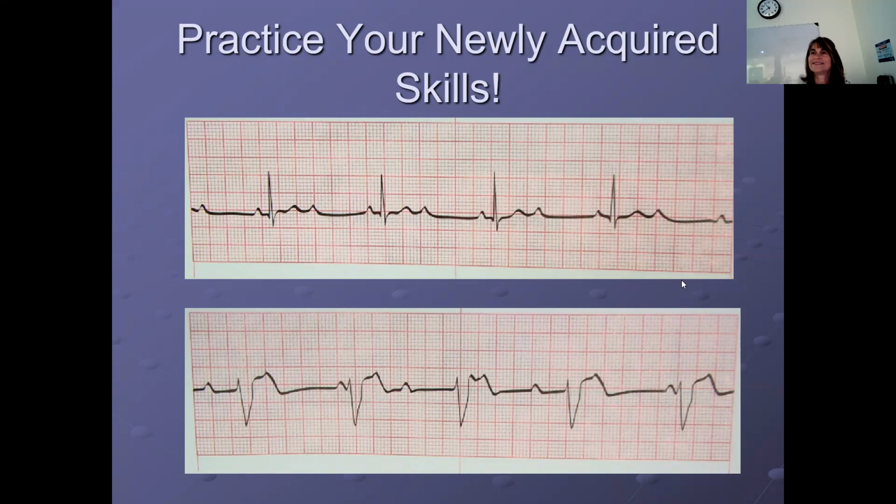That's how we're going to have to answer them, with the 2-to-1, 3-to-1, 4-to-1. Is that only for type 2? Yeah. That's 2 P waves? This is a T wave. Is this the one you're referring to? Yeah, you always have a T wave. So you find that first and then you know that it's not.